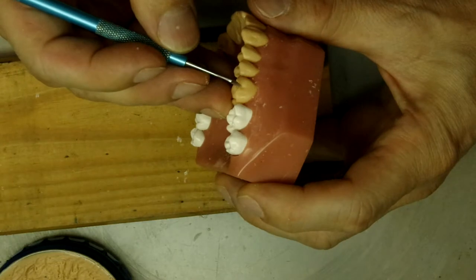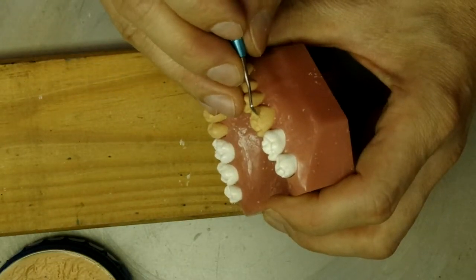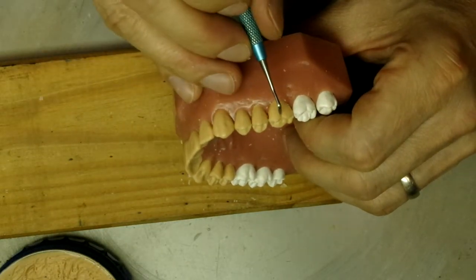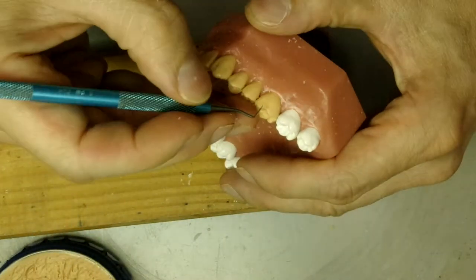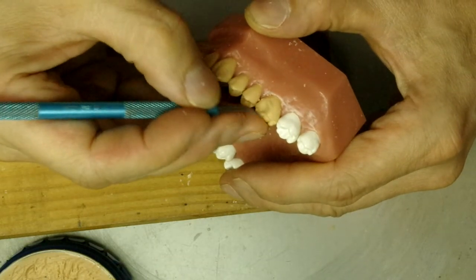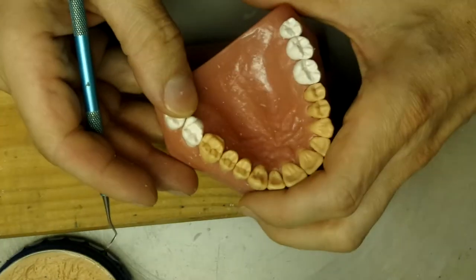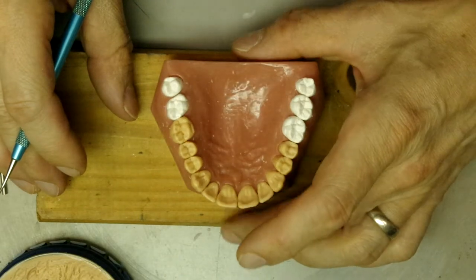We have the buccal developmental groove here - just don't bring this all the way down. You can make it sharp but only go about one quarter, then you fade it out, and it becomes one piece by the time you get to the half of the tooth. And that's basically your molar right there.